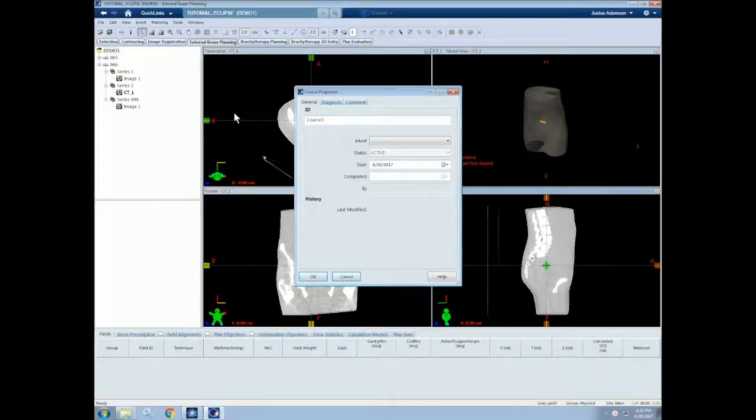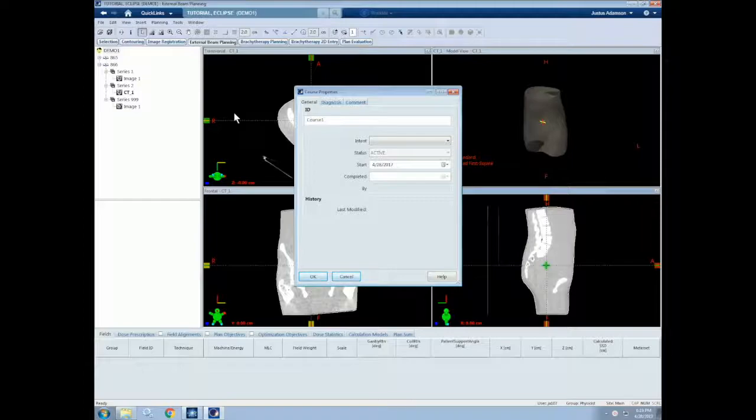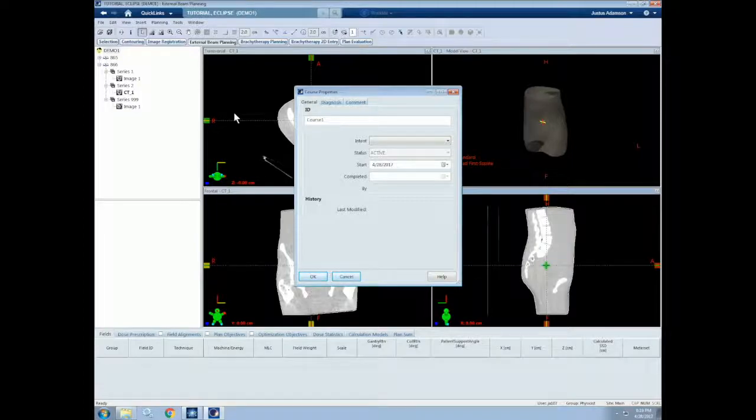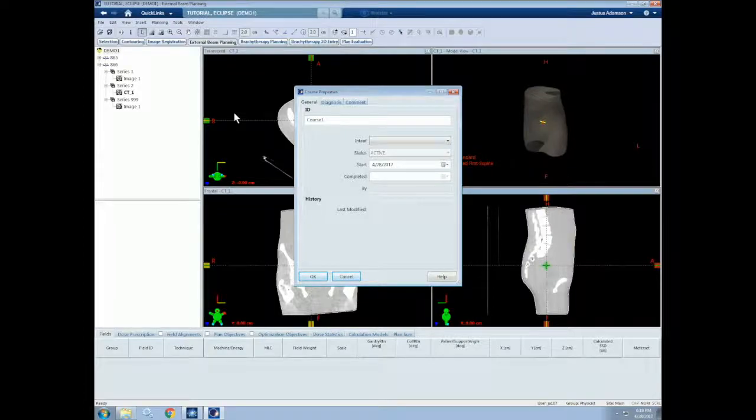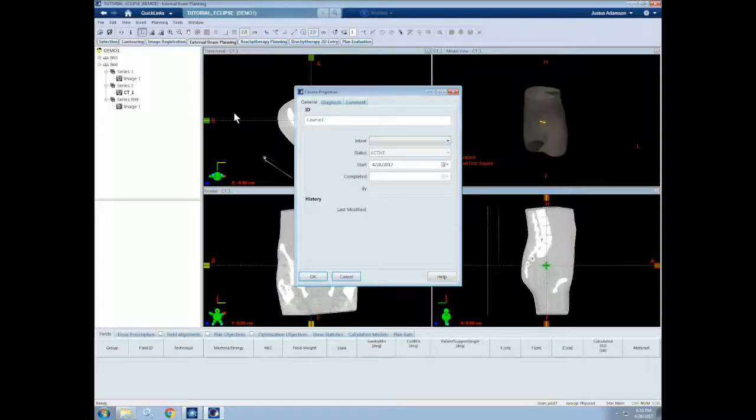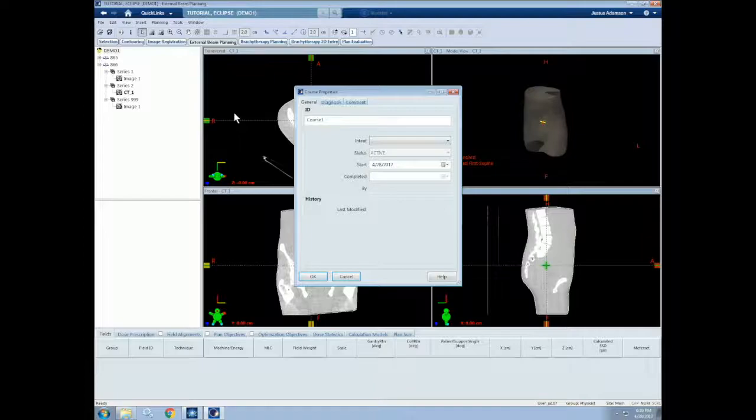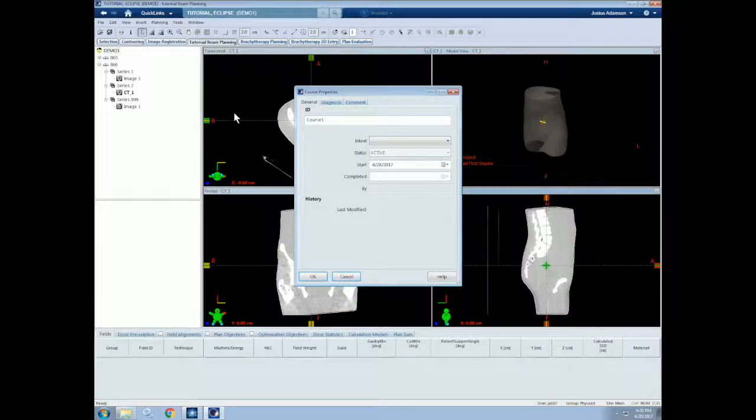A course is used to store multiple plans. Clinically, a course is used for each round of treatment a patient receives. For example, the first time a patient comes in, a course will be created for them, typically named C1. If that patient needs to return for future treatments, a second course will be created, typically named C2. Courses are useful for storing previous treatments, separating different treatment sites, and keeping non-clinical plans separate when doing research, training, or quality assurance.